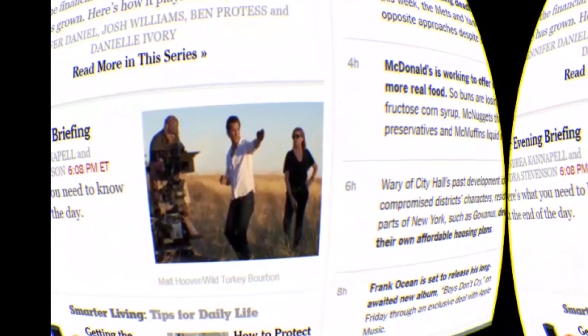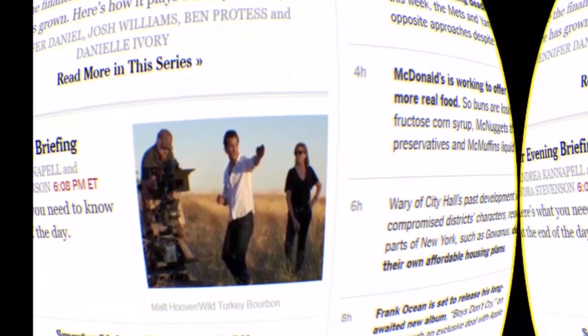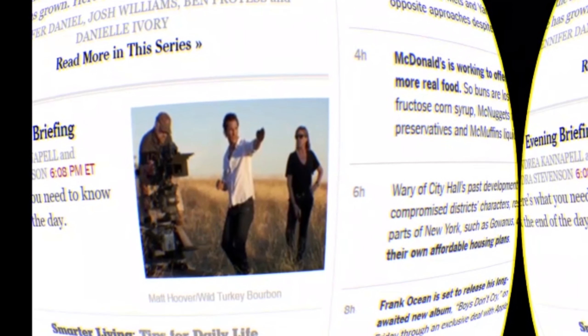IrisVision gives a low vision patient access to the world of digital media. Patients can read a newspaper in giant relief on the largest IMAX-like screen, or view email or other documents and photos in enormous relief.